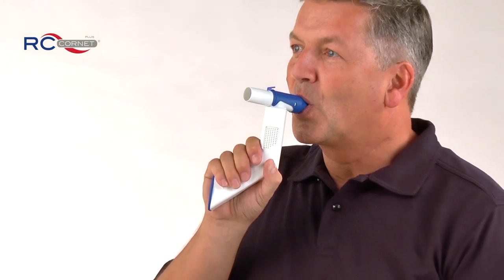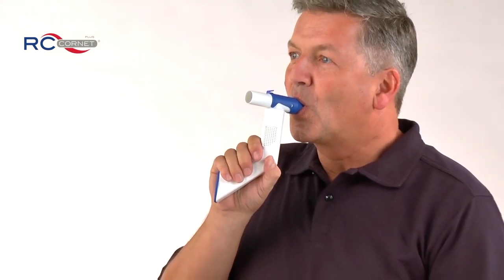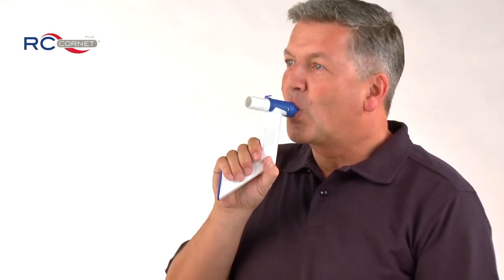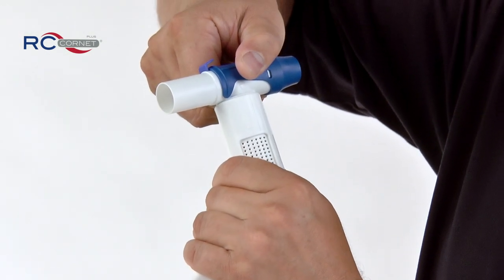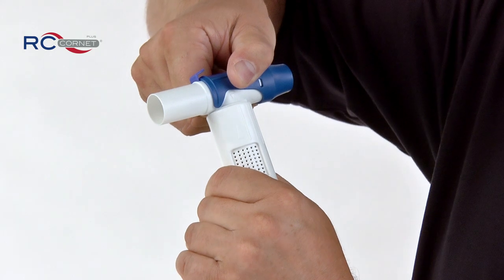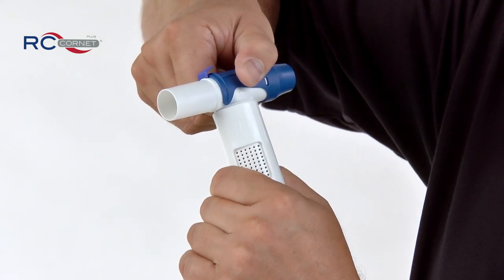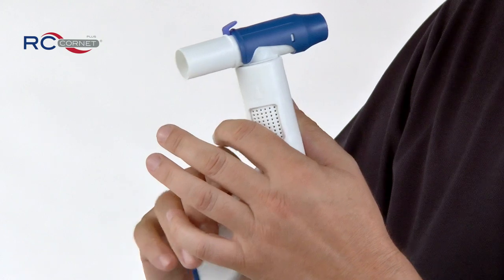Once secretions have been removed from the airways, the cough reflex diminishes automatically. By turning the body of the device, patients can set the level of their own exhalation pressure. The initial setting is recommended for patients with severely limited lung function.